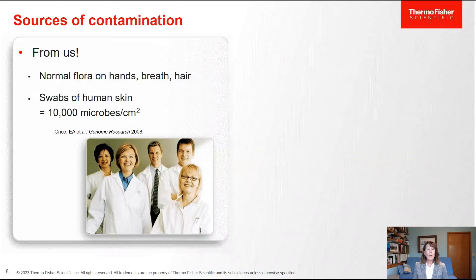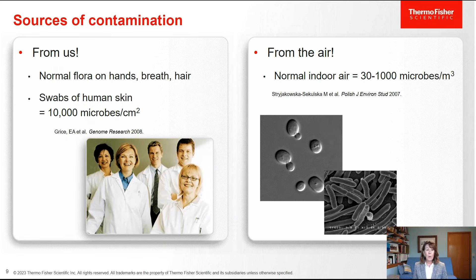So where do these contaminants come from? For microbial contamination, the most common source of microorganisms is from us. We all carry on average 10,000 microorganisms per square centimeter on our skin, and these microorganisms are also around us in the air. Normal indoor room air contains between 30 and 1,000 microorganisms per cubic meter. These microorganisms are ubiquitous in the laboratory environment, and it's critical to use proper aseptic technique to prevent them from getting into your culture.